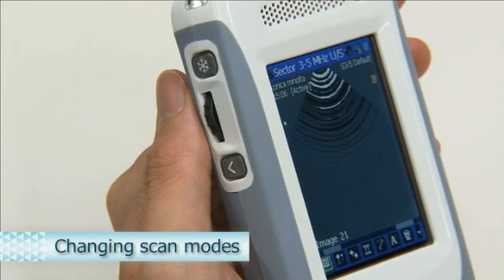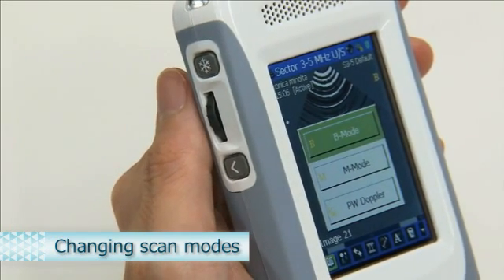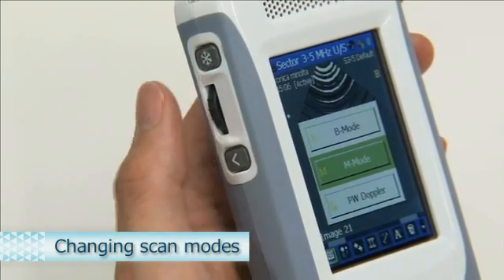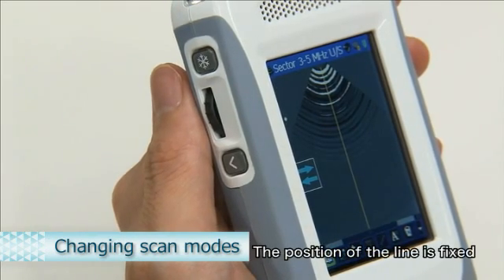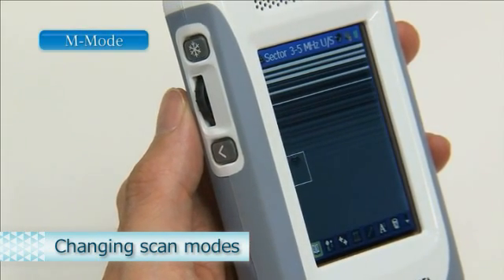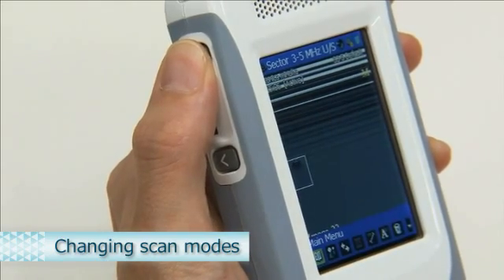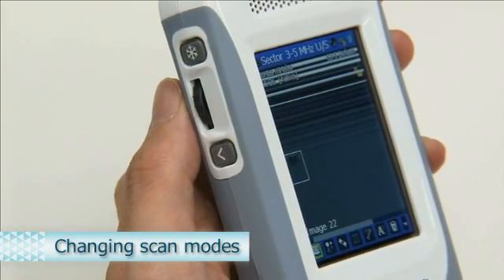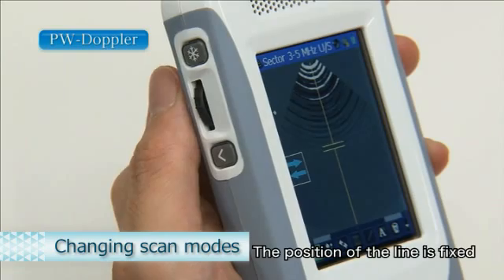To change the scan mode, with the image frozen, press and hold the Scan button. The Mode Change screen is displayed. Use the scroll wheel to select the desired mode, then click the scroll wheel to confirm. Press the Scan button again to start scanning. To use M Mode, confirm the position of the M Mode line, then use the Back button to display the M Mode waveform. To switch to PW Doppler mode, perform the same operation, select PW Doppler mode, press the Scan button and align with the position of the line, then press the Back button to display the waveform.